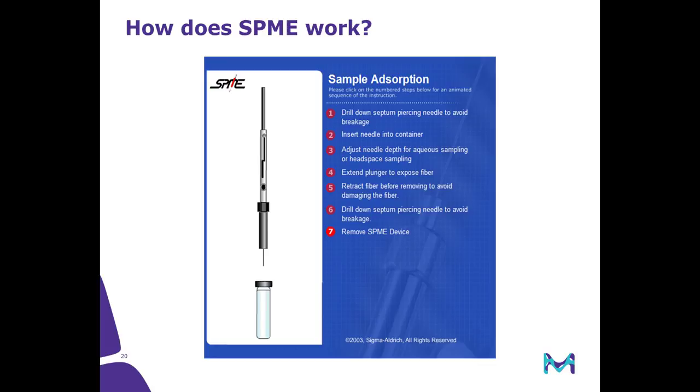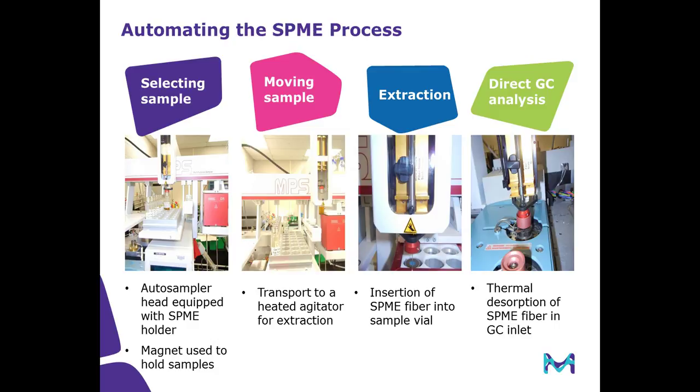So unlike a solid phase extraction where you use the device once and throw it away, you can use this device over and over and over again. And what I've shown here is how it's being used manually. It can also be automated very, very easily.